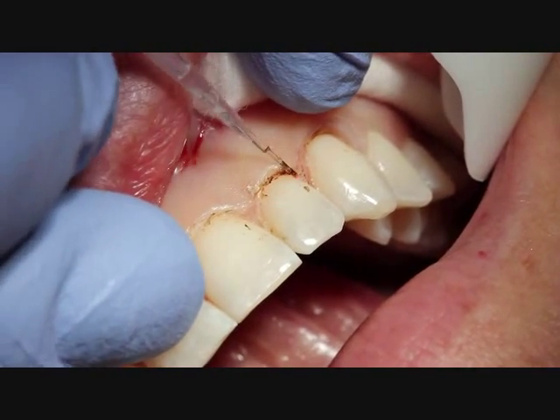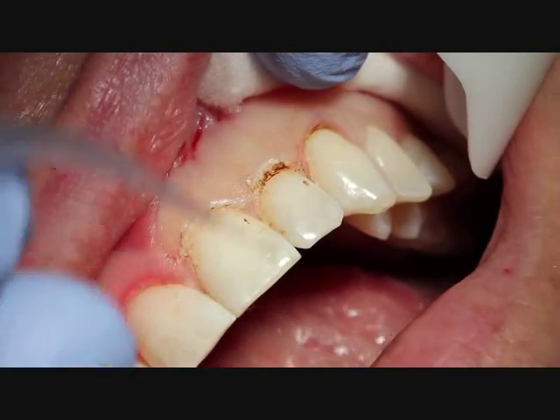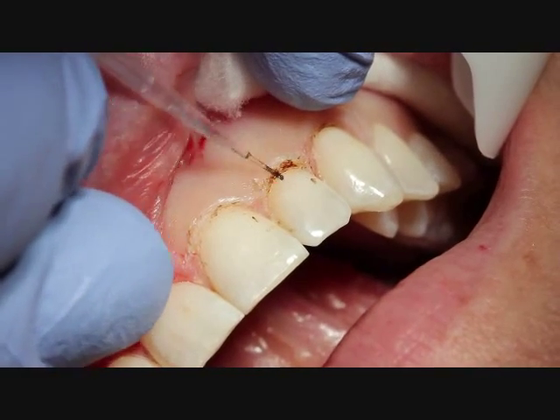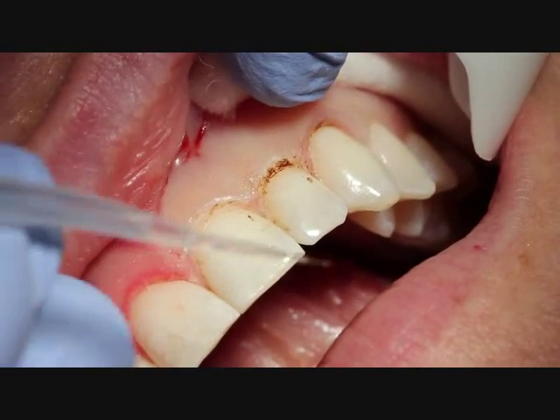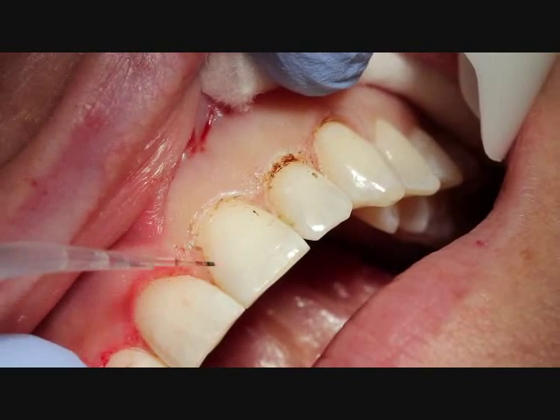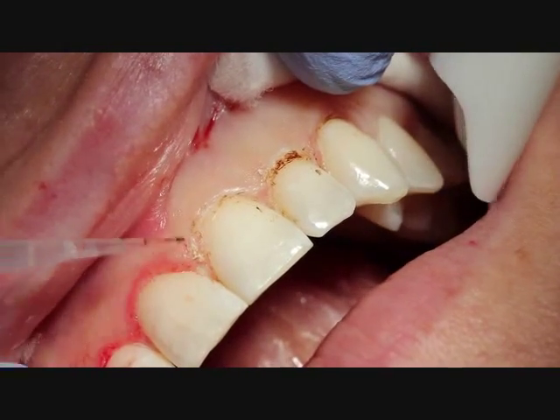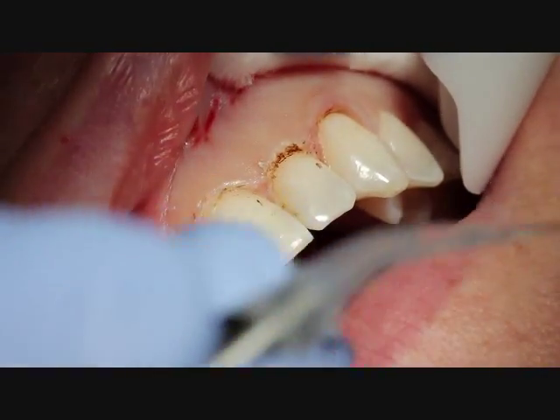Here you see we're just doing a little touch-up. There's a little pigment on the tip which is being sort of marked onto the tooth surface. We keep the tip moving — the amount of heat generated by the laser will not have an effect on the tooth if you keep the tip moving. And we're just cleaning up some tissue tags and getting our length just the way we want it, going back and forth to create that nice little appearance of a little longer length to those anterior teeth.